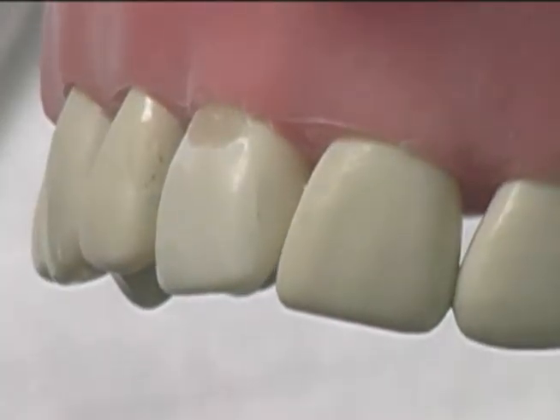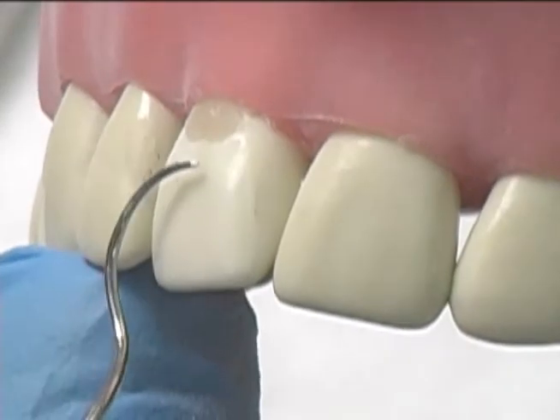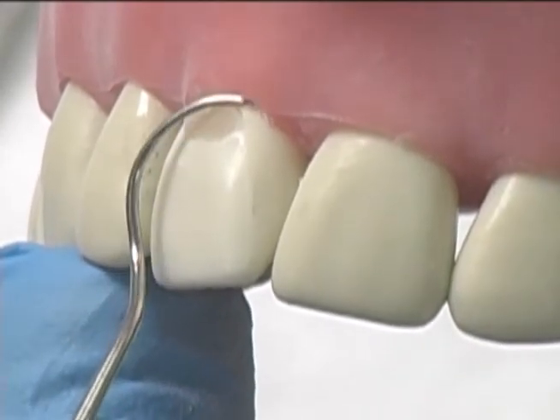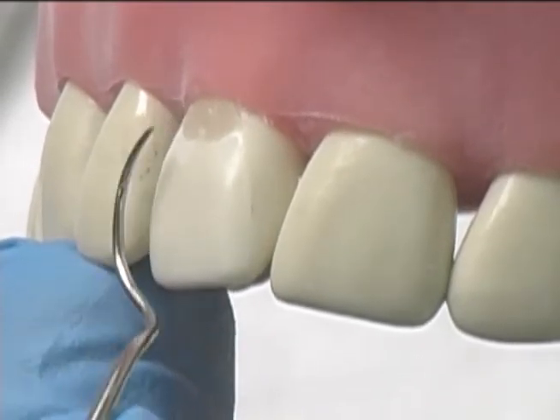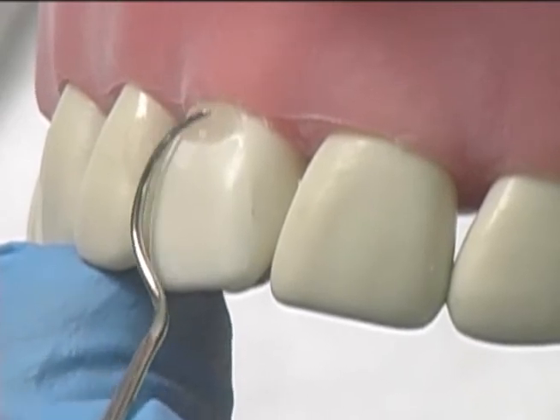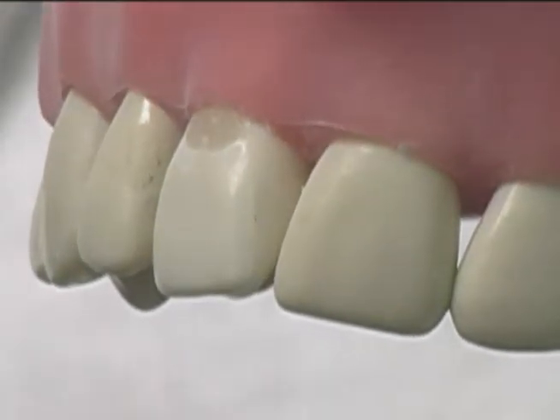And then recheck the margins. Your dentist will normally perform this composite finishing with a handpiece. Recheck the margins for smoothness and confluency with the cavo surface of the tooth around the preparation. I can feel just a little more overhang there. It would be time to tell your dentist it's time for a... Bring the handpiece back in.